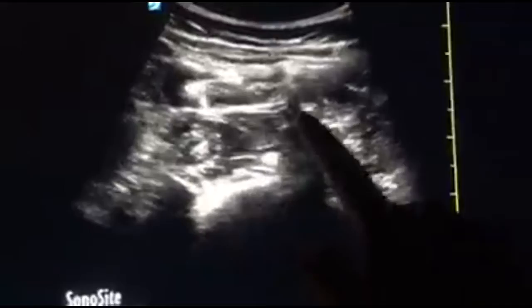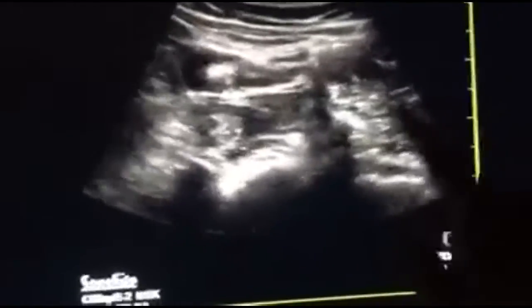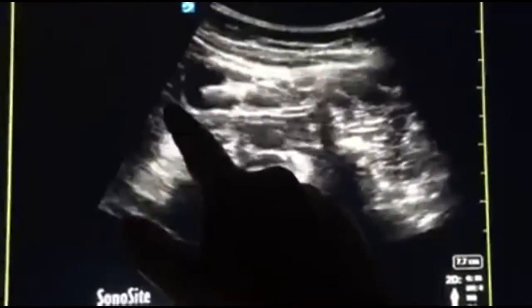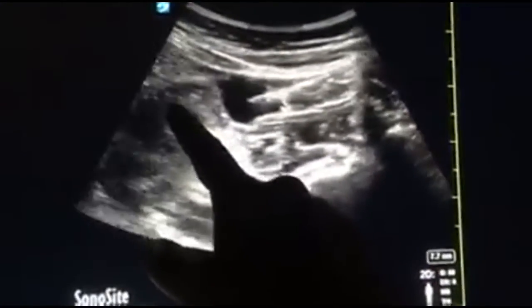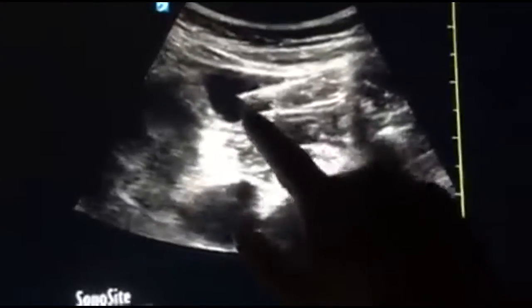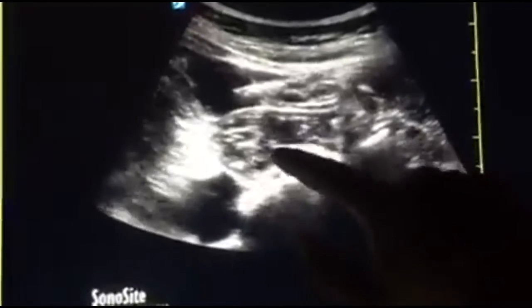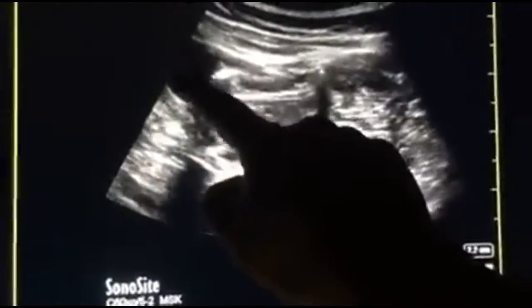I have injected some at the anterior most part of the quadratus lumborum muscle. Psoas, quadratus lumborum, transverse process, vertebral body. All right. Here are the erectors. All right. So this is the perinephric fat, or whatever you can say. The transversalis fascia here. All right. Okay. And the local anesthetic is getting deposited anterior to the quadratus lumborum muscle, and on top of the psoas. This is psoas, this is quadratus lumborum, and the local anesthetic is very much there.